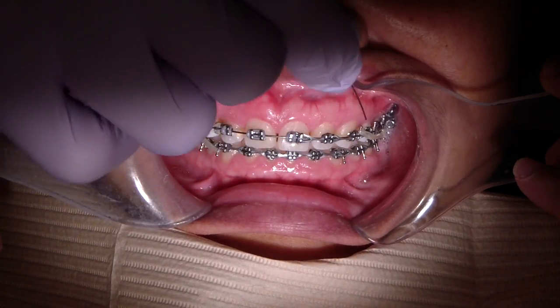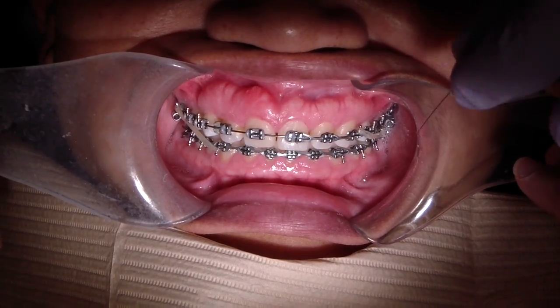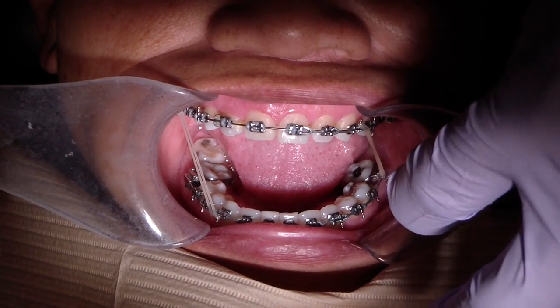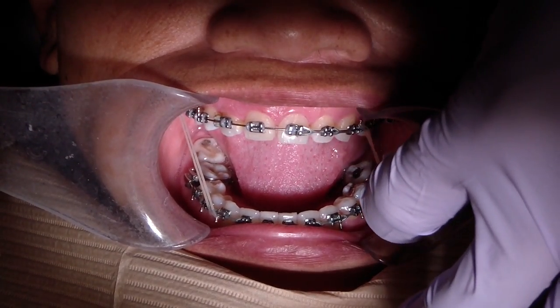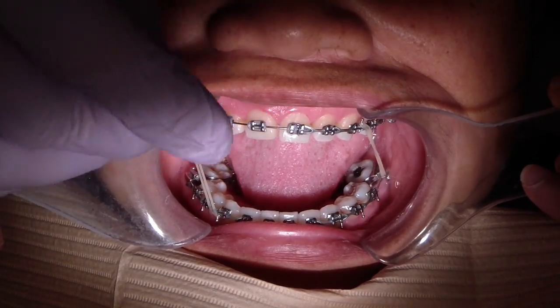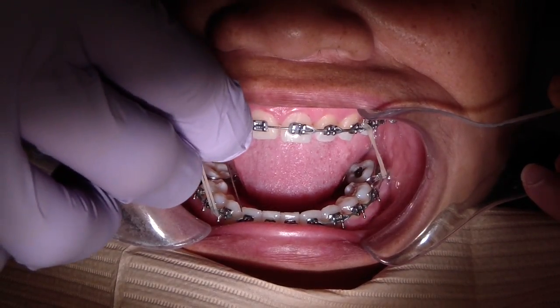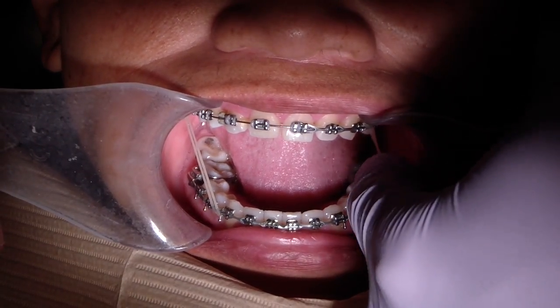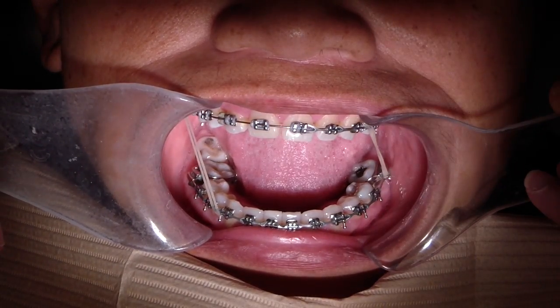We have class 2 elastics on her left side — you can see here it runs from the molar to the canine — and what we're trying to do is get bodily movement to mesialize that molar. We've closed up all our spaces on the mandibular arch, and now the final step is to mesialize that molar.